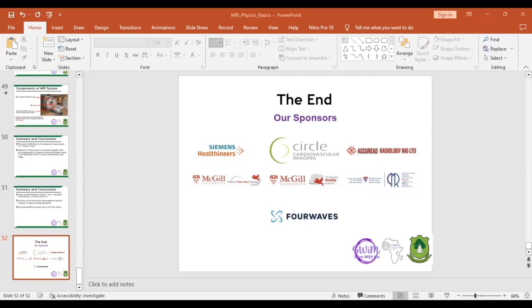So I would want you to go back and check very well before you finally select, to be very sure that you are selecting the darkest myocardium. And if you are not selecting the darkest myocardium, adjust your protocols when you are running the TI Scout to give you an image that is not mimicking any artifact. That will help you to select the right myocardium, which you will most likely use to plan your short axis scan during the post-contrast phase. I don't know if I helped in any way in that instance, Wally.